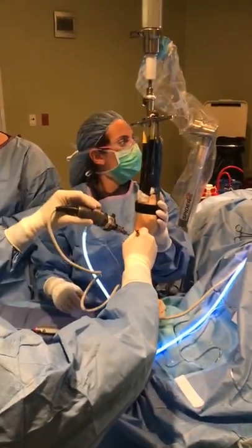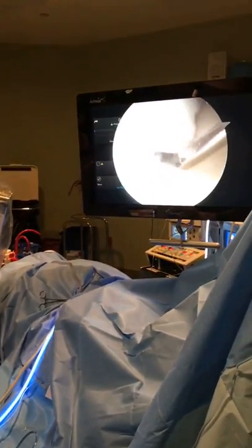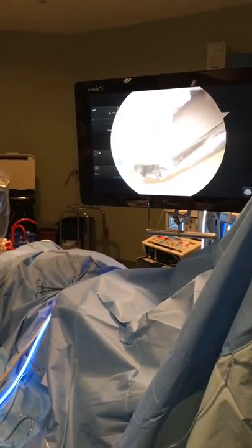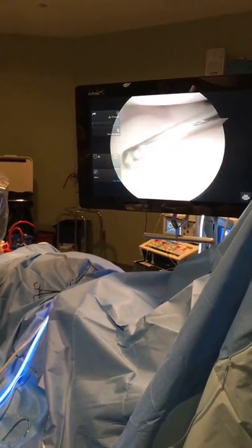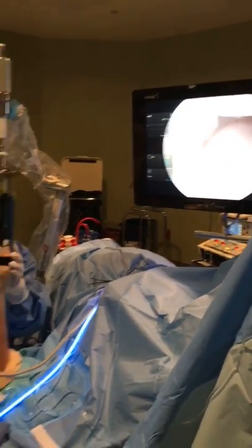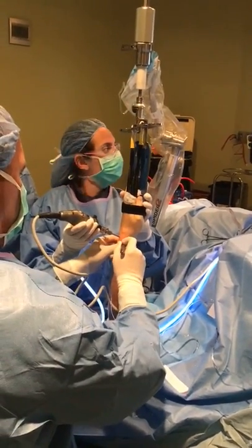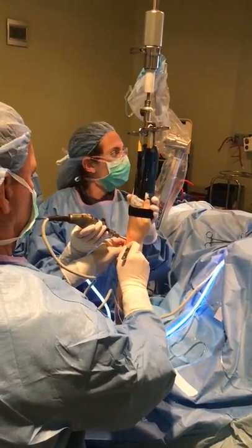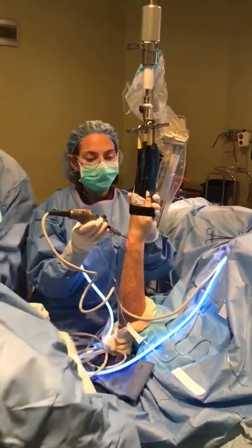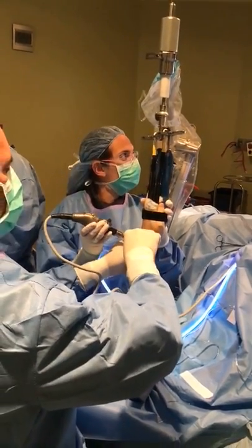Years ago I published a technique where we used a suture that we weld. It's actually pretty cool, but I like this one. This all inside technique means I don't have to, okay. Now we're going to make the hole a little bit bigger because I have to get this instrument in.